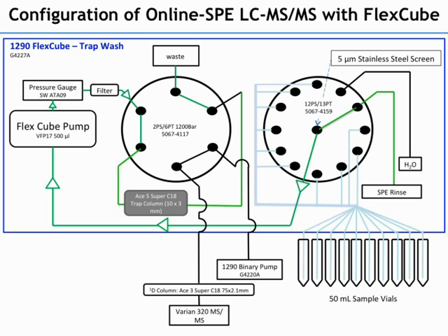If we don't have that screen there, what we think is going on is that when we centrifuge the samples, we have some low density material, like when we're dealing with wastewater effluent, some tissue, toilet paper residue in there that doesn't centrifuge well. And we don't take any other means to remove that from the sample. We don't have a filter because then we have losses in the filtration. So we find that mesh, it's not a filter per se, not a porous filter, because porous filters have too much flow restriction for it to work. We've tried that. So it's really important that it's a screen. But that screen, that 5-micron mesh size, seems to work pretty well.